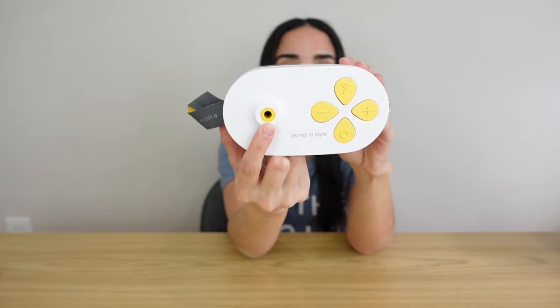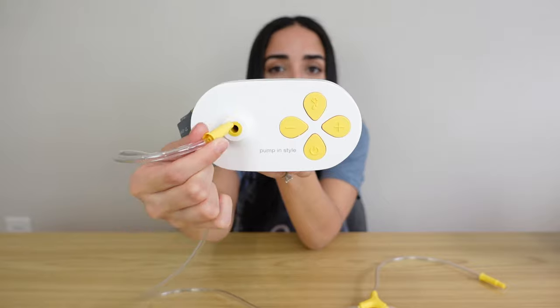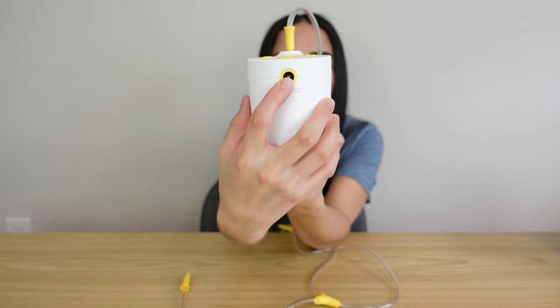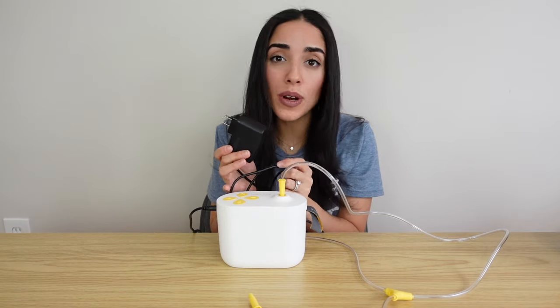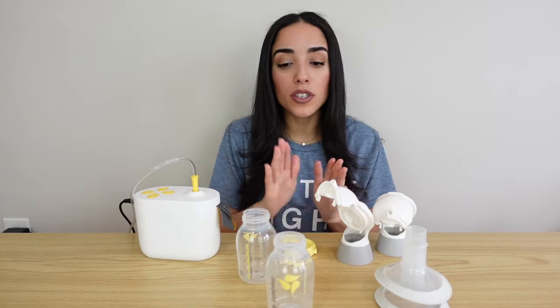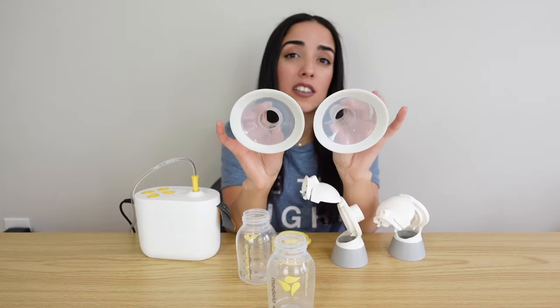Now we're going to be assembling the entire pump. Starting with the motor — you'll notice a hole where you insert the tubing, with the single-piece side going right into the motor. There's also a hole for either your wall plug-in or battery pack. Next we're going to assemble the pumps. You'll need two bottles, two connector pieces, two membranes, and the two flange sizes of your choice.